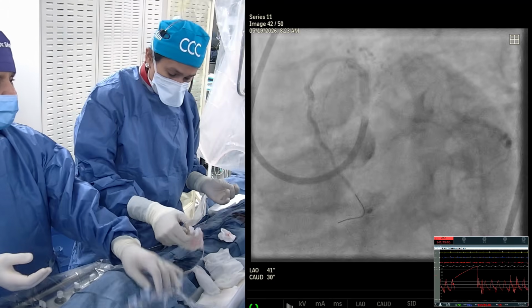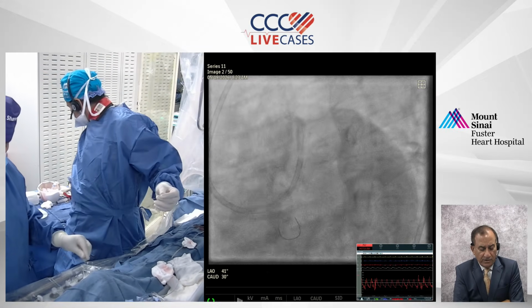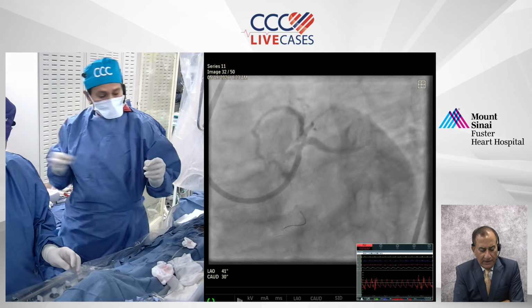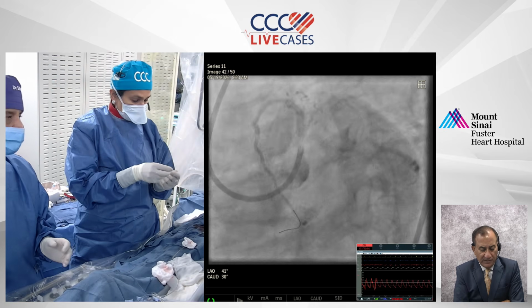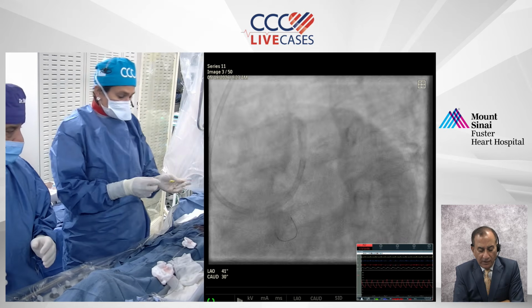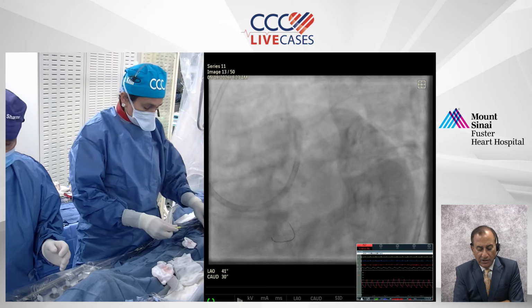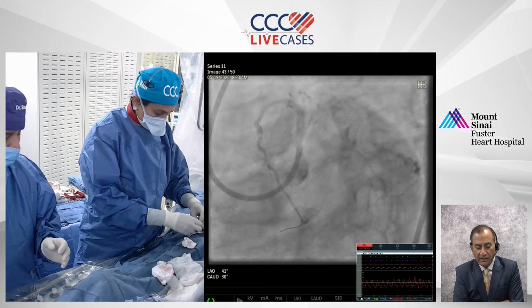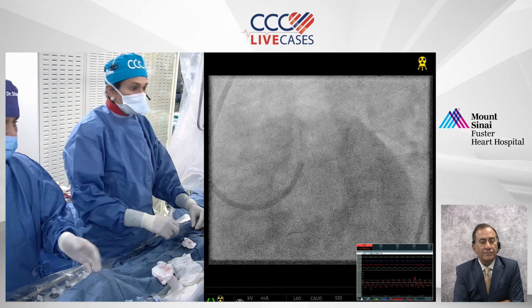All excellent questions coming in. Here is another very specific one from Dr. Mohammed. I know he's been with us several times before. I'll read it exactly as he mentioned. Of course, he first of all said, good morning, great team. Shouldn't you advance the burr while pressing on the brake defeat button and a second operator fixing the wire? Yeah, so that's a very good point.